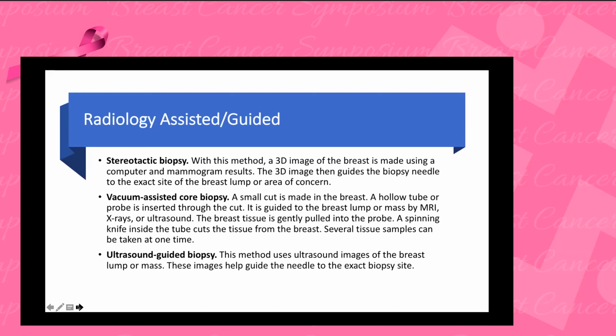Now, this is just a slide showing you radiology-assisted guided biopsy. I'm sure the radiologists will talk about this. We've got our stereotactic biopsies, vacuum-assisted core biopsy, as well as ultrasound-guided biopsies.